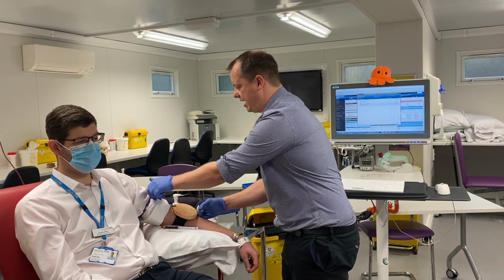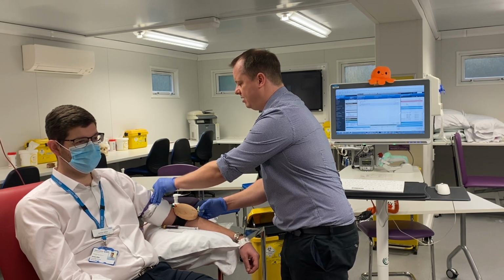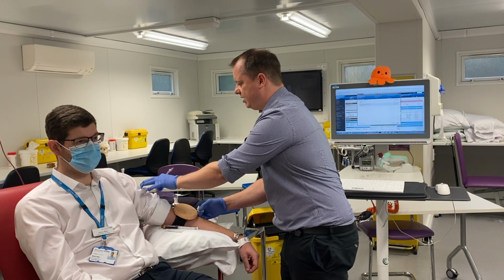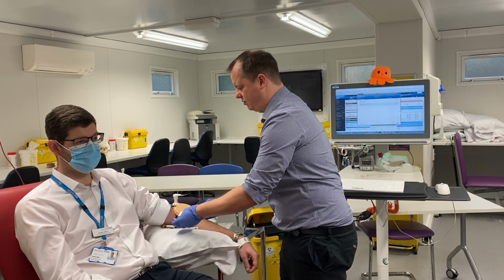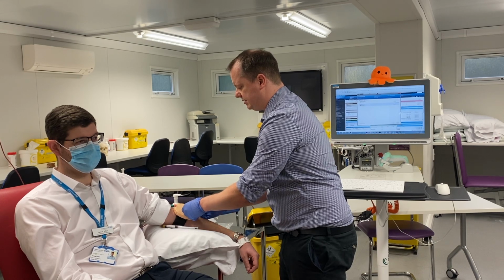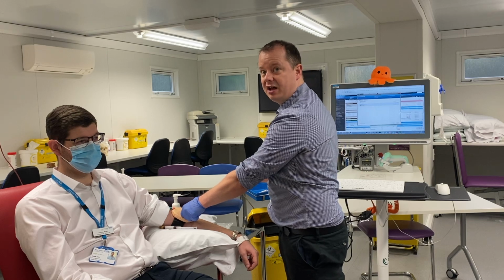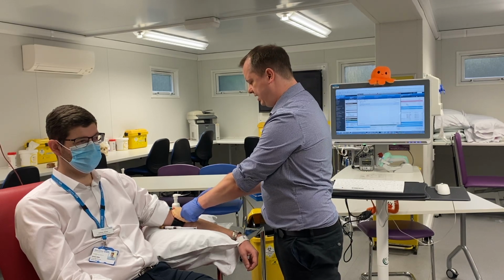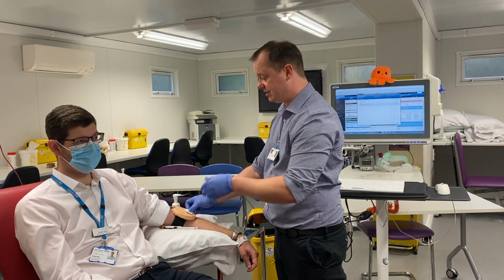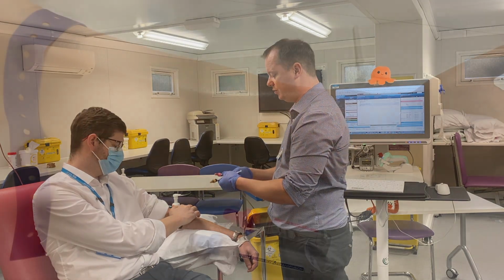And then what I need to do now is release my tourniquet. This can be a little bit tricky for some people because you want to be very careful not to jog the needle, but if you just use one hand to take the tourniquet off, that can come out relatively easily. Get your gauze, place it over your needle, and then pull your needle out and then push down firmly on the patient's skin. Activate my safety device, drop my needle into my sharps, and then you can ask the patient to push onto the gauze for you.